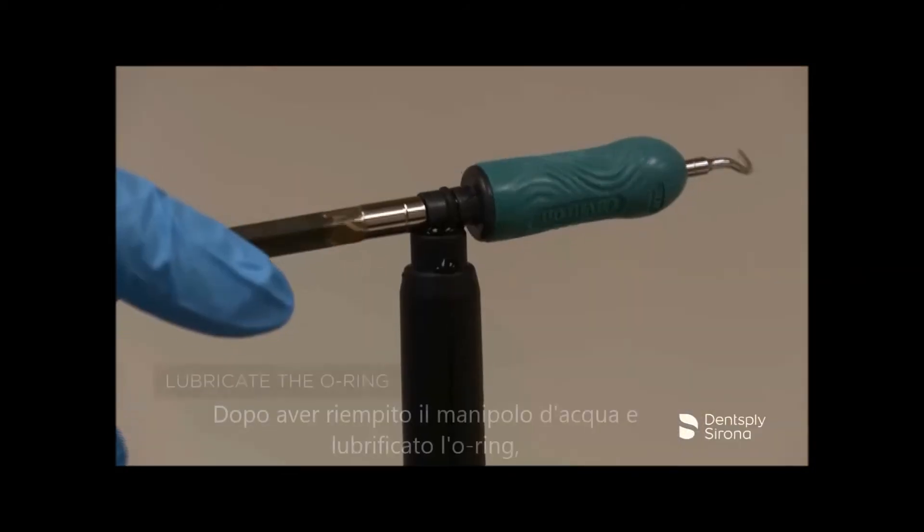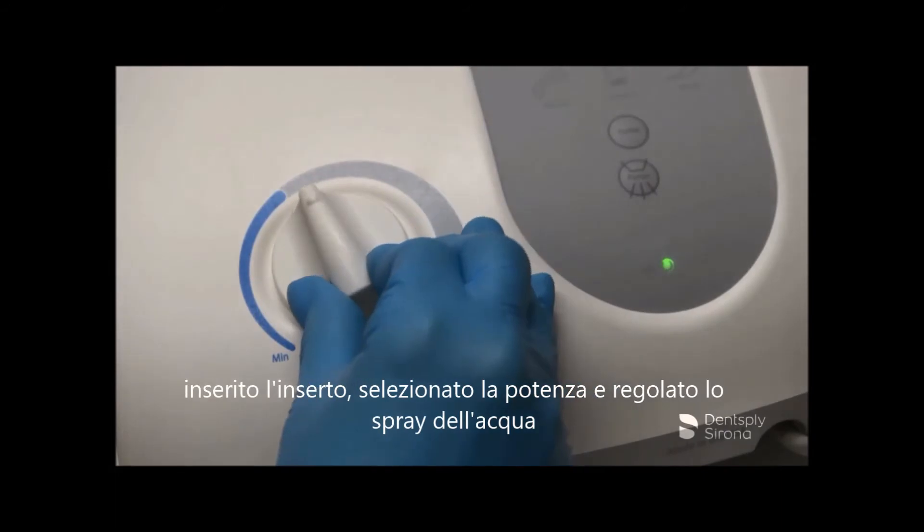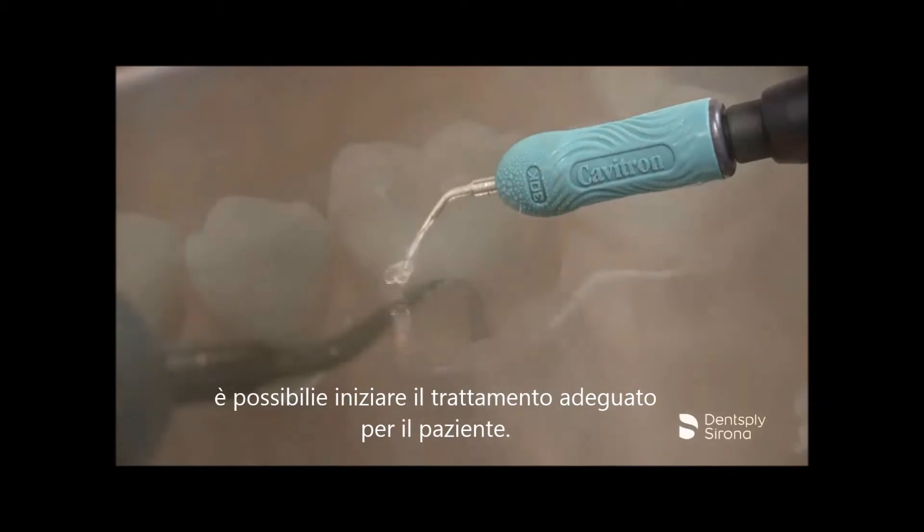After the clinician has filled the handpiece with water, seated the insert, selected the power, and adjusted the spray properly, instrumentation begins according to the treatment plan prescribed for the patient.